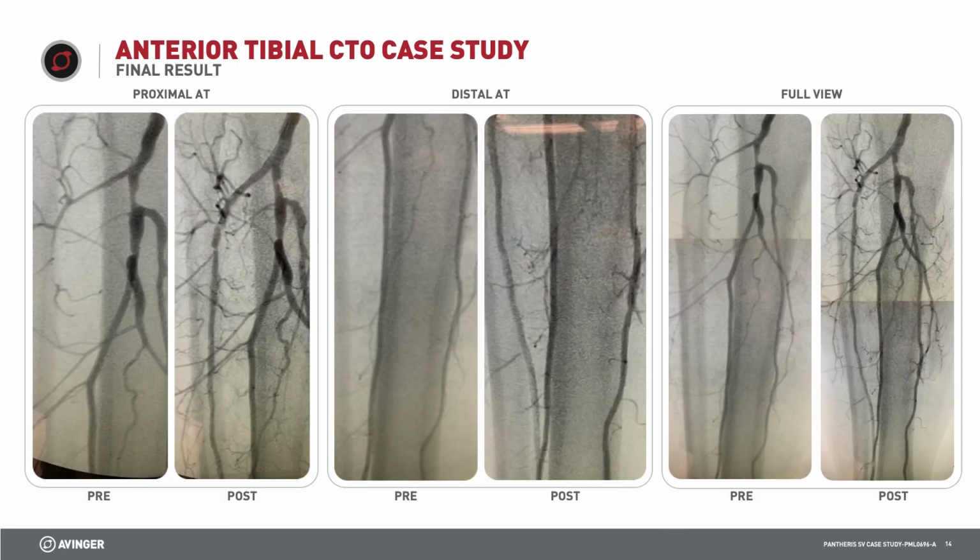And now the slides that you'll see are the before and after images. Now, what is remarkable about these before and after images, not so much that there was no anterior tibial artery before and now there is an anterior tibial artery. We all see that every day, right? You can open up a tibial artery. What's extraordinary about these images is that this is atherectomy alone.